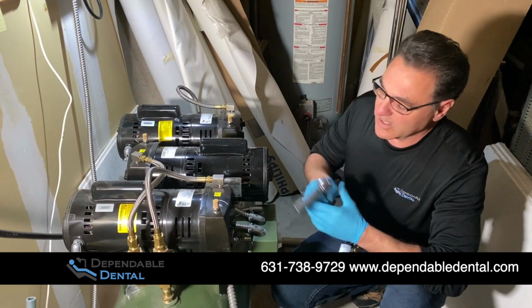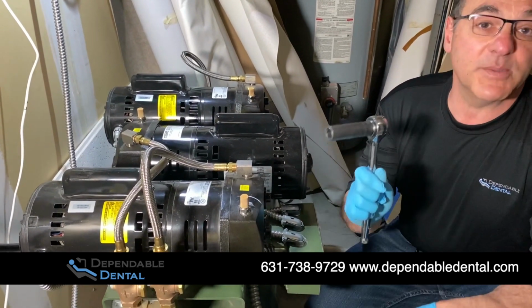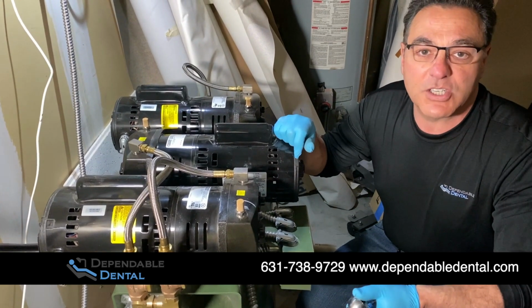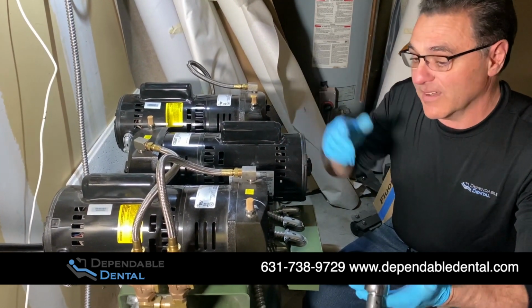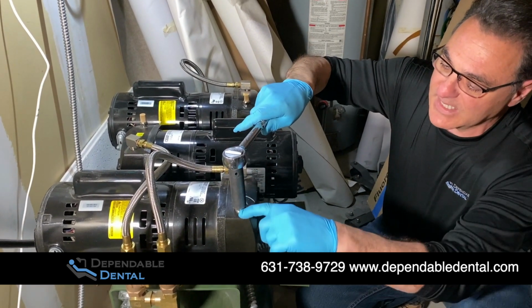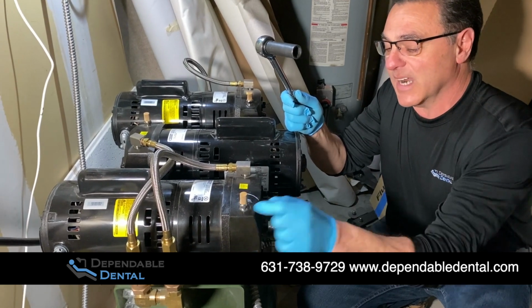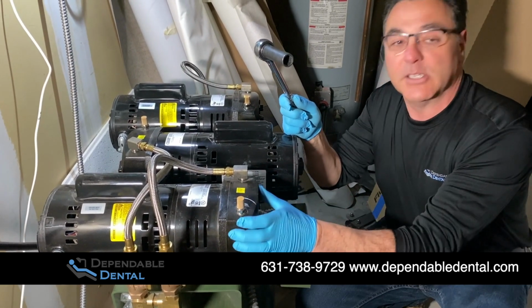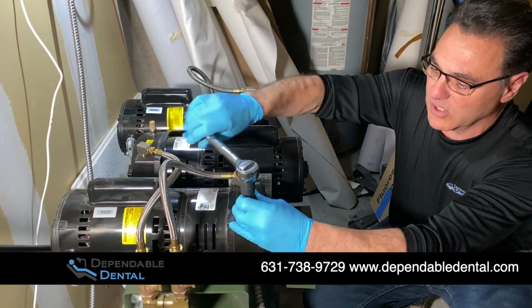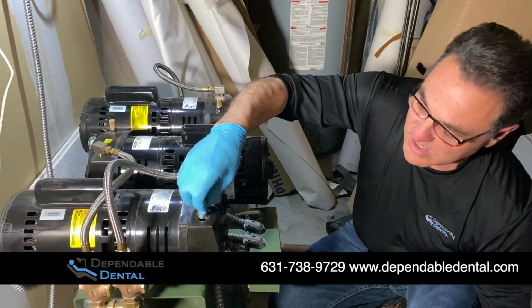So right now we're going to be changing the muffler. Our tools are basically just an 11/16 socket. If you don't have that, you can use a large adjustable wrench or an 11/16 wrench. These mufflers tend to get stuck within the head. The mufflers are made out of steel and the head is made out of aluminum, and the aluminum is much softer. So you want to be very careful not to cross thread, and make sure you get a nice smooth release on it. Once it's nice and smooth, you can take it out.